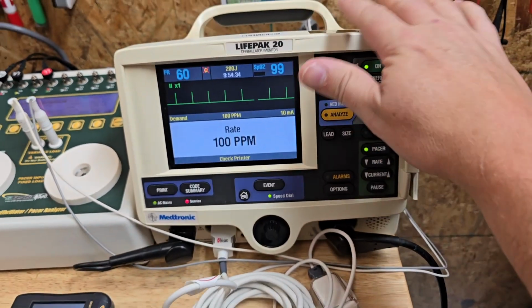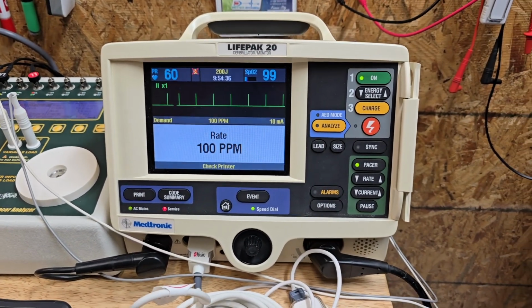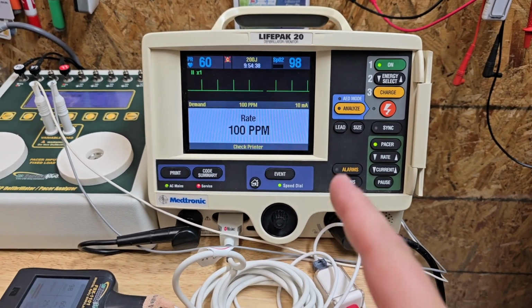To be expected, this poor guy is definitely out of calibration, but who cares? It's not for patient use. You get the gist. Anyway, guys, that's just a quick rundown. And if all these modern day defibrillators are having pacing, then we should be able to maintain those defibrillators correctly. And that means having the correct test equipment. Having a pacing enabled defibrillator analyzer is an essential tool for a modern day biomed. And that is why I recommend it.